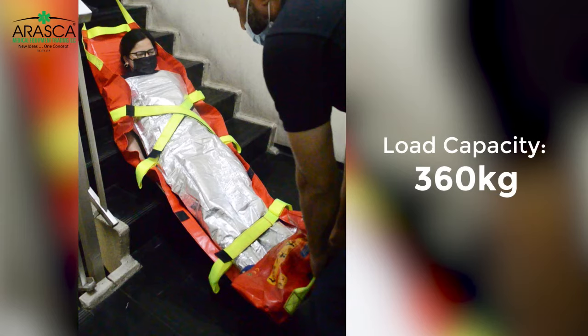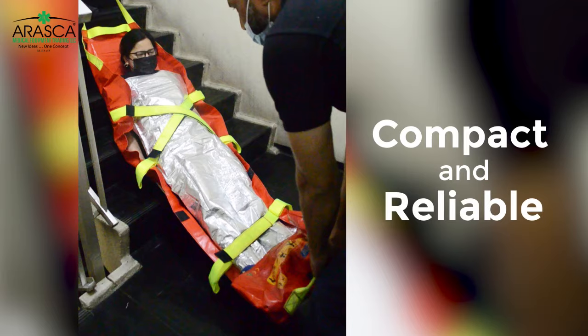The ALBUT mat can carry up to 360 kilograms, making it a compact and reliable evacuation solution.